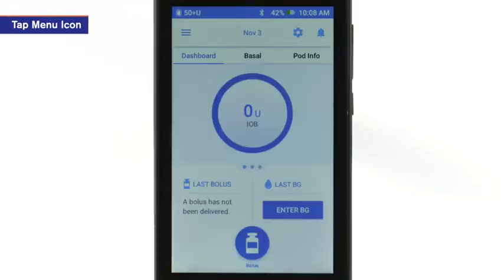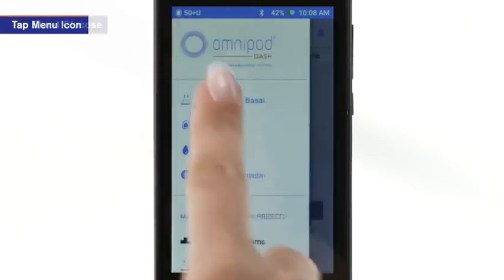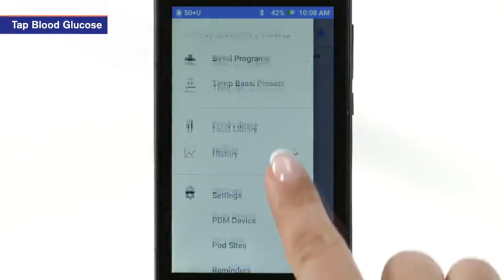To begin, from the PDM home screen, tap the menu icon. Scroll down to and tap Blood Glucose.